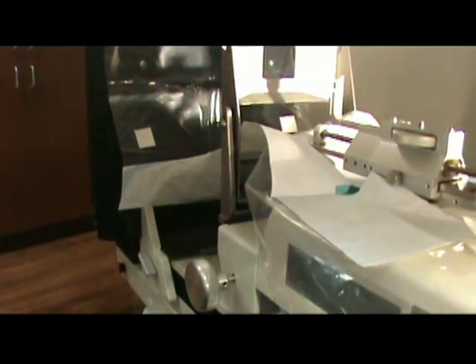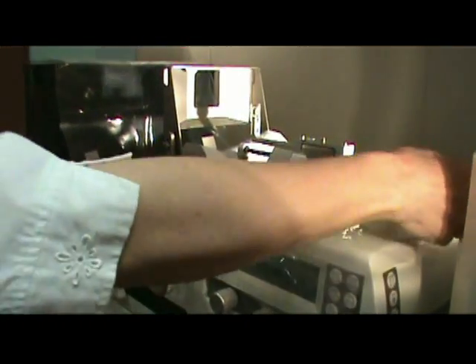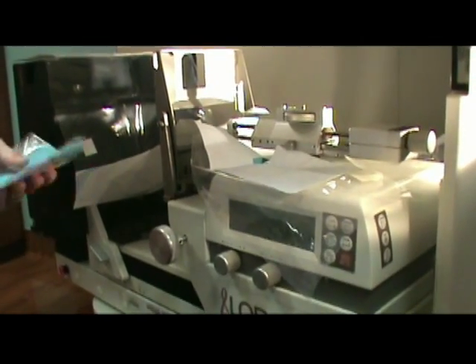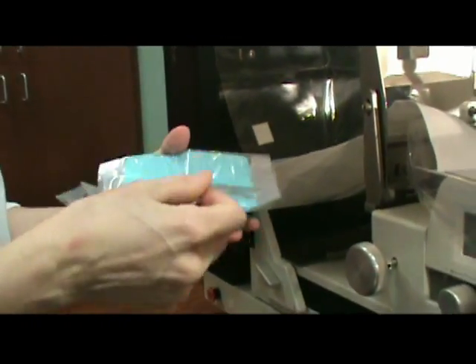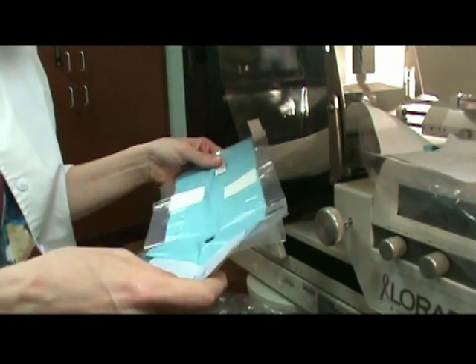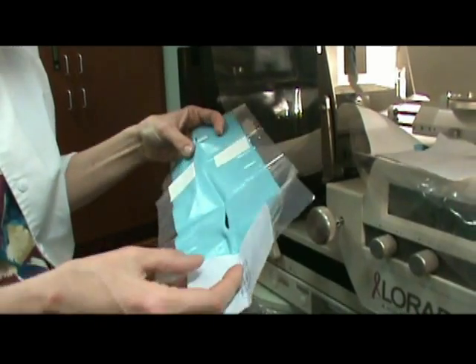The third part is the actual needle guide portion. This piece actually also includes a 4x4. Depending on what type of biopsy needle you use, you may need some additional coverage right underneath the needle area.